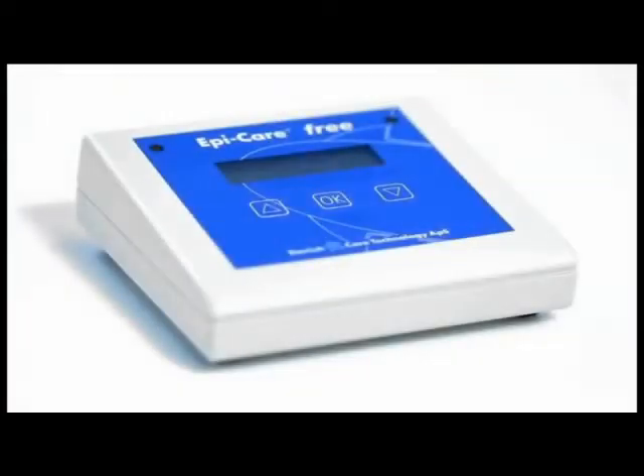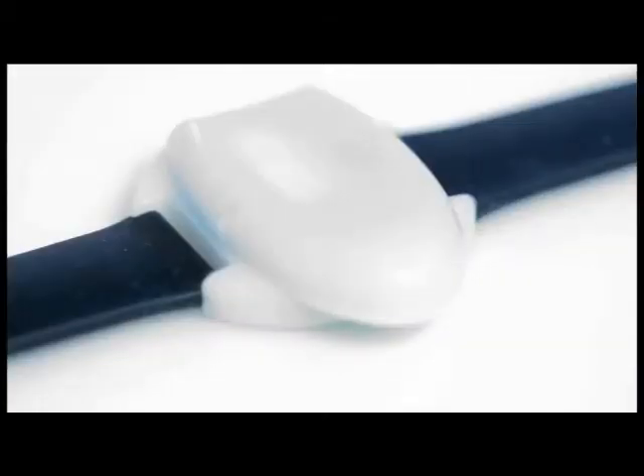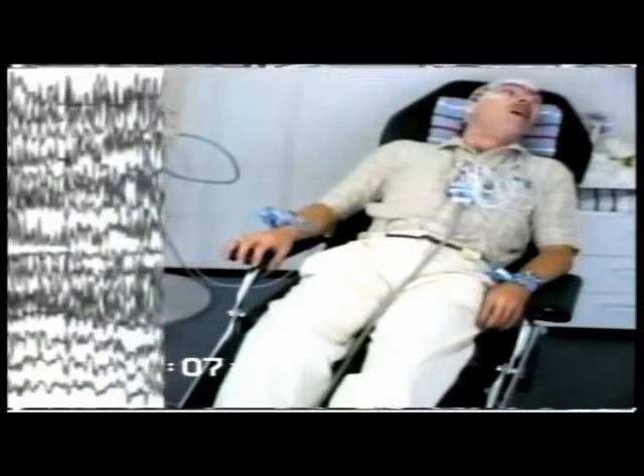EpiCare Free is a brand new alarm developed for people who have epileptic seizures. The armband contains precise three-dimensional microelectronics that continuously monitor the arm's movements and determine whether they are of an epileptic nature. The alarm detects tonic-clonic seizures.